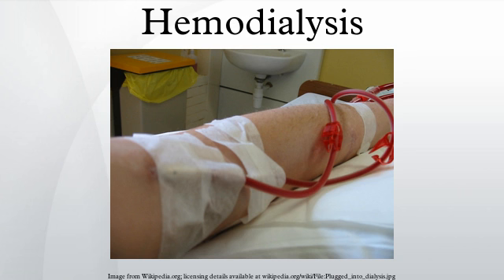Types. There are 3 types of hemodialysis: conventional hemodialysis, daily hemodialysis, and nocturnal hemodialysis. Below is the adaptation and summary from a brochure of the Ottawa Hospital. Conventional hemodialysis. Chronic hemodialysis is usually done 3 times per week, for about 4 hours for each treatment, during which the patient's blood is drawn out through a tube at a rate of 200 to 400 milliliters per minute.